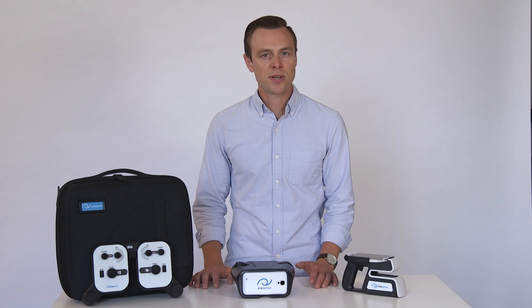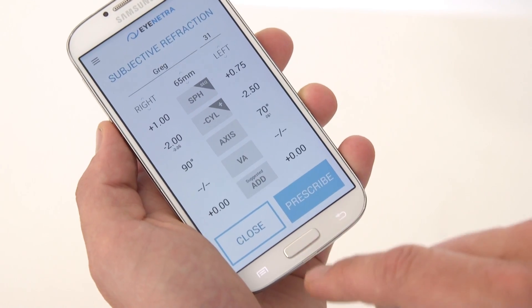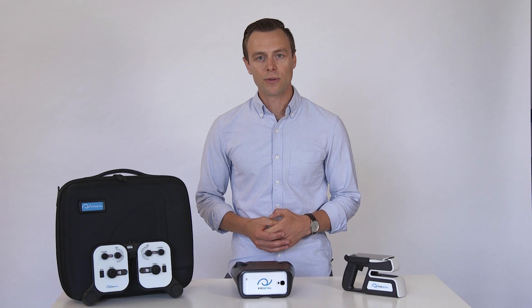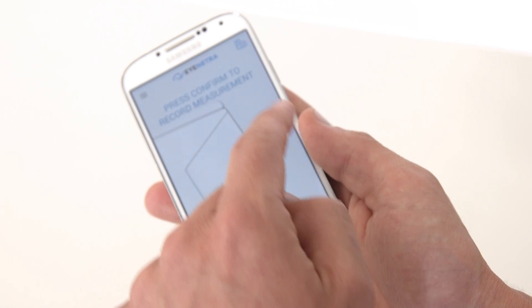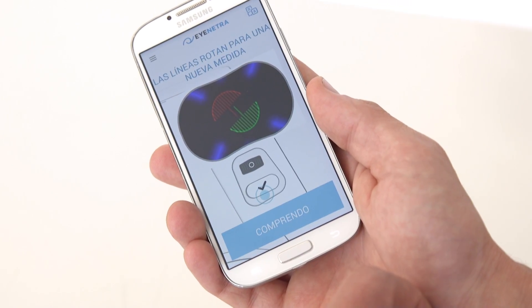The patient will operate the device using the controls to perform a series of simple alignments in a virtual reality environment. The test takes approximately two minutes to complete, after which a technician may remove the phone to review the results. The results can then be tagged with a patient ID and saved on the phone, or adjusted and emailed directly to the patient. The Netra autorefractor comes with a built-in tutorial in more than 10 different languages to make training your patients easy. It requires no external power source and no calibration, and its precision is on par with many of the top-tier autorefractors on the market today.